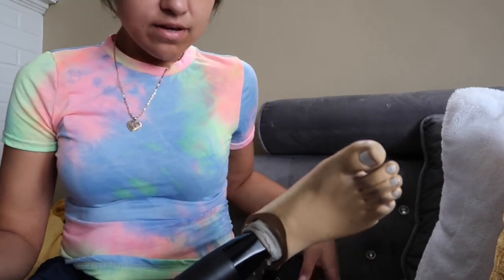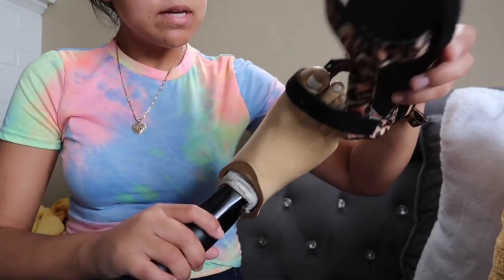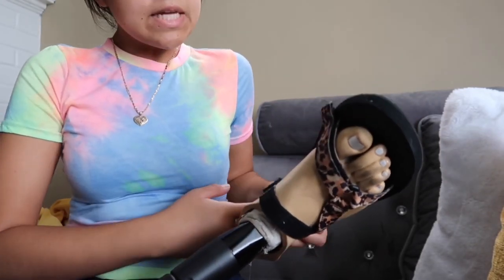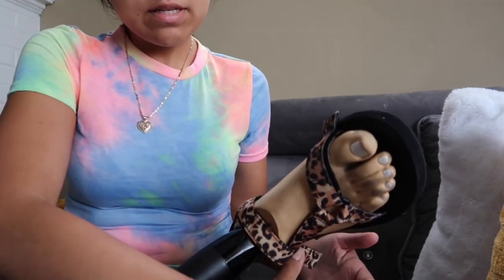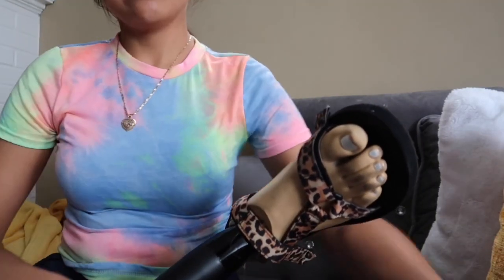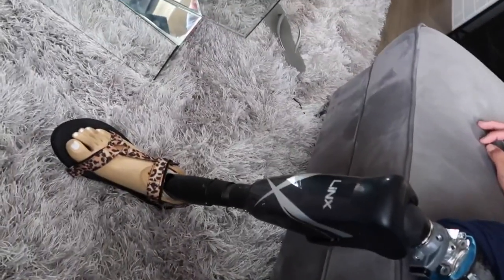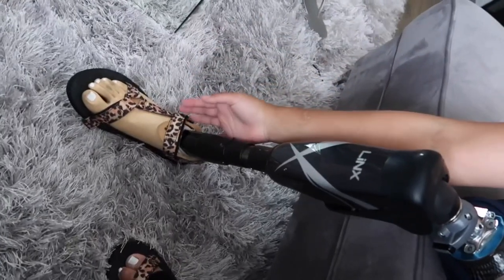Now, same way, same time I have to use the rotator as well, is when I'm putting them on. I'll put them on. It's a lot easier. And then I'll just, done. It's that simple. And then again, I'll click. There we go. It would be a lot harder. I feel like it would be more difficult to try to do it this way.